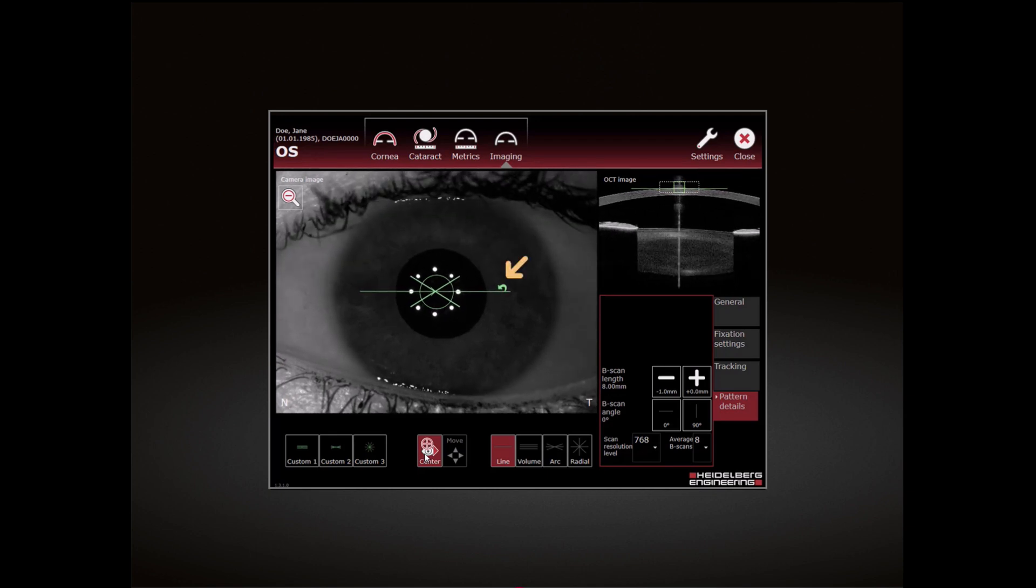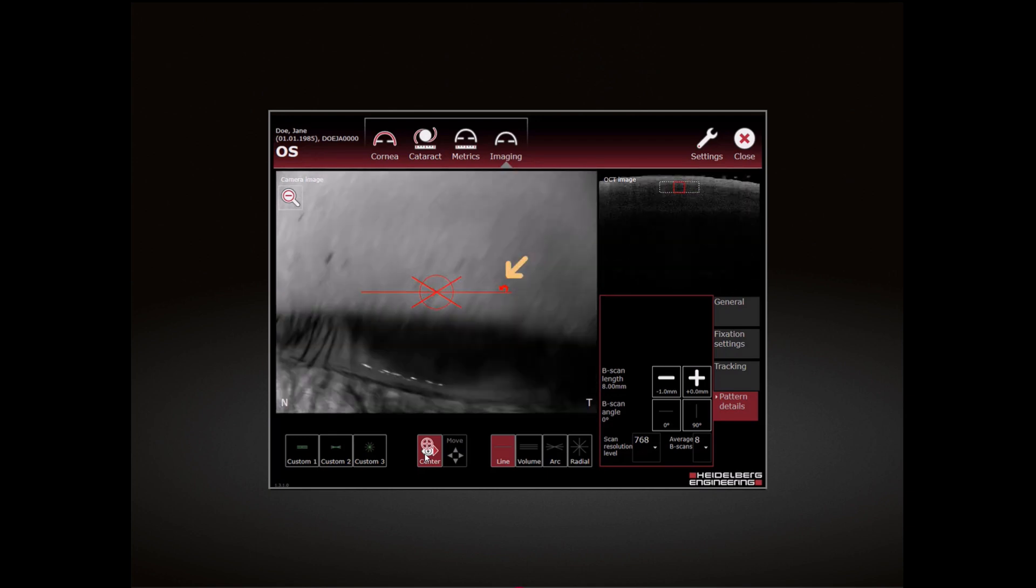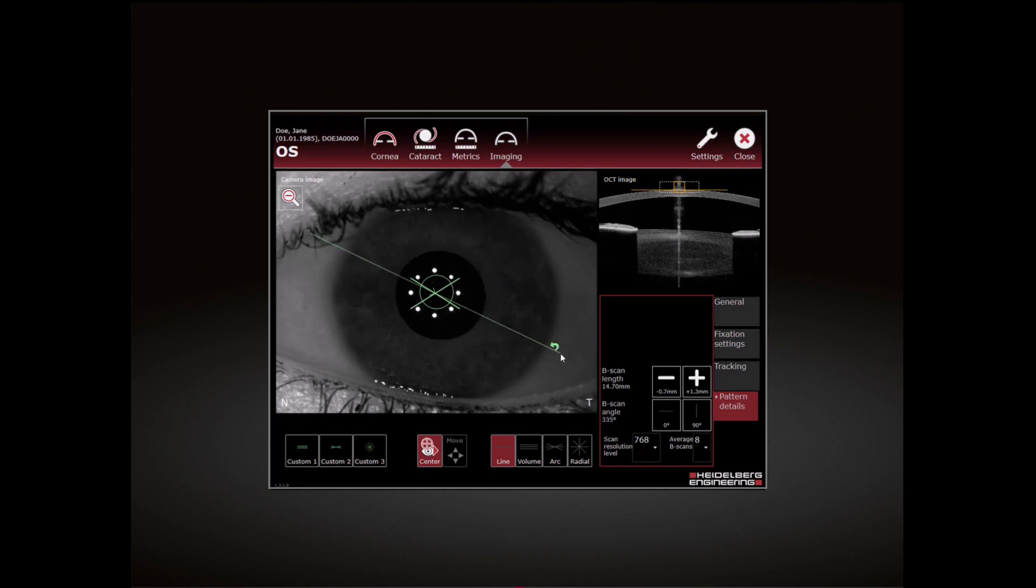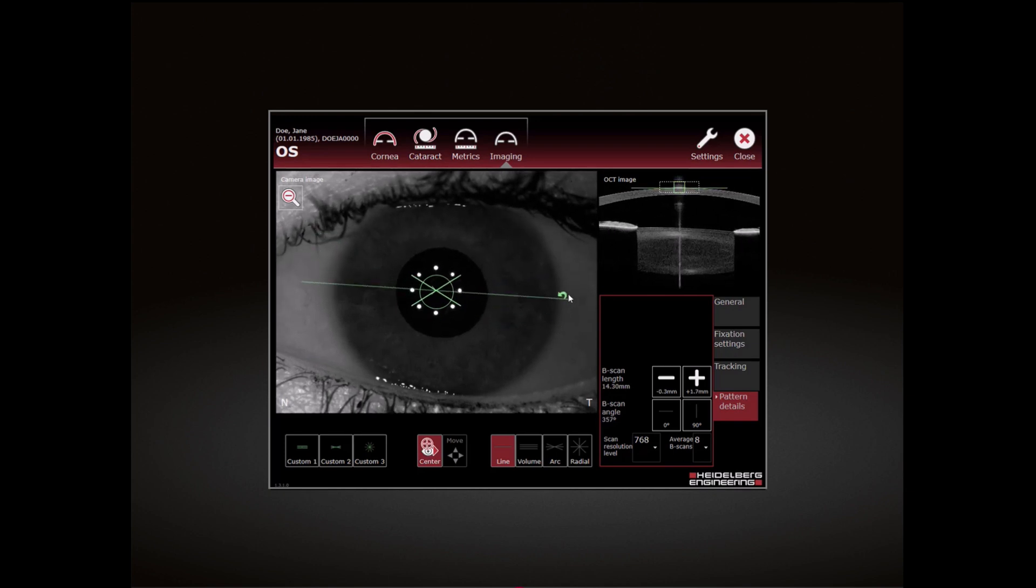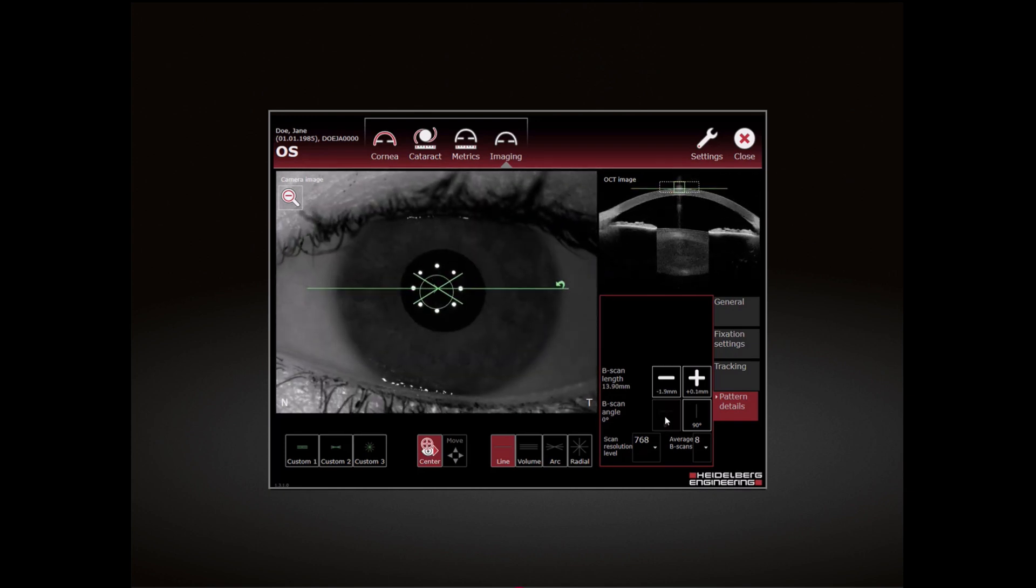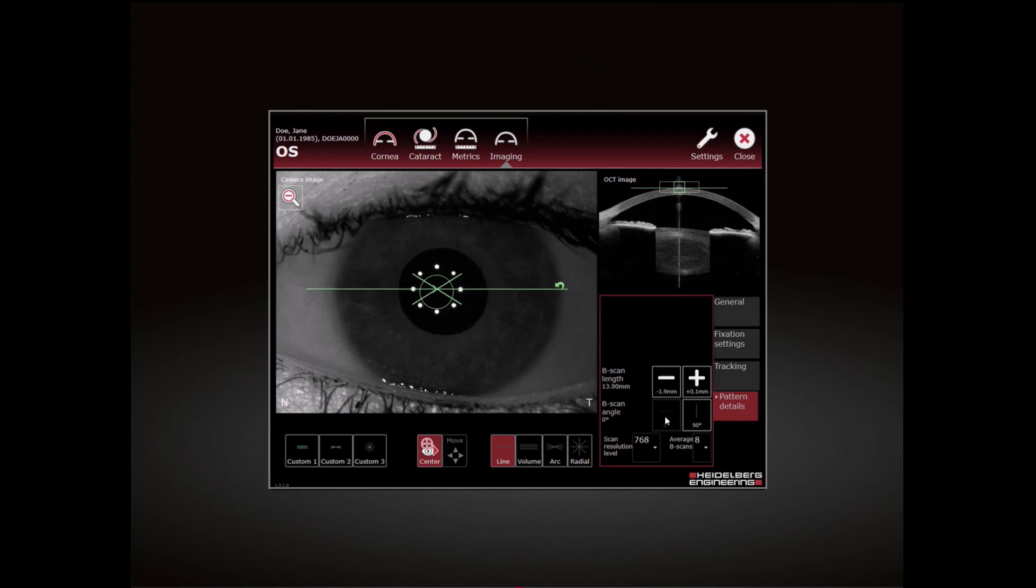To change the scan angle, tap and drag the end of the scan pattern to the desired scan angle.